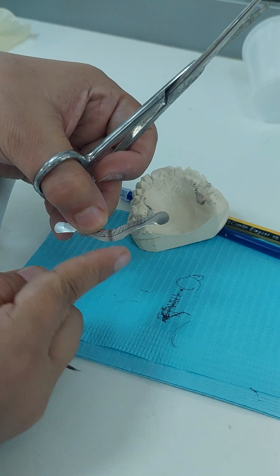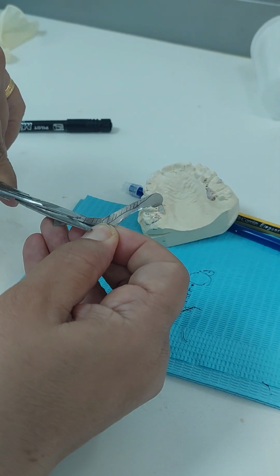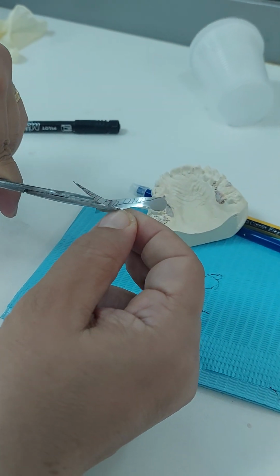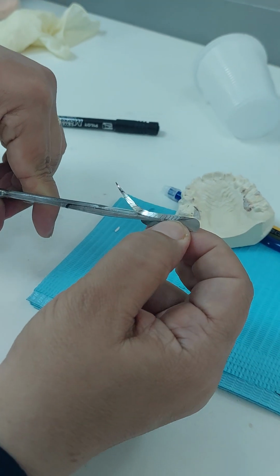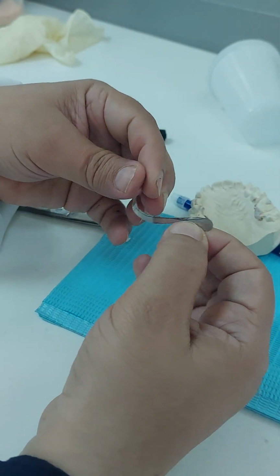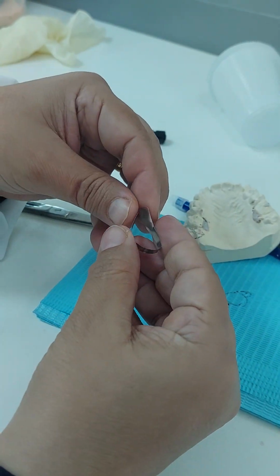Now this is now going to the gingiva. Once more, this is going to the gingiva. It's going deep. When I remove the upper part, I'm changing the emergence profile. So it's no longer flat, forcing me to go vertically from the deep marginal gingiva. Now, when I'm going to wrap it around the tooth, okay, what will happen? I'm going to wrap it.